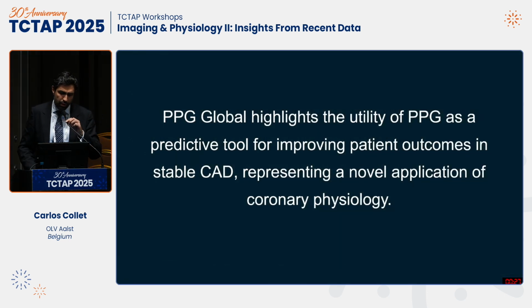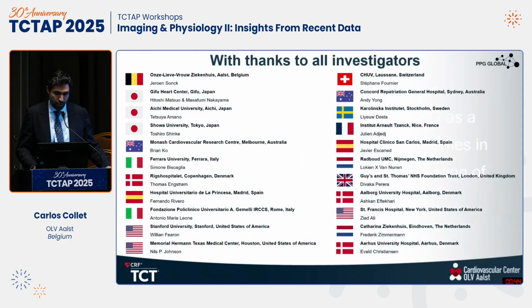Therefore, I think we can conclude that this PPG Global, this is a 1-year follow-up, highlights the utility of PPG in predicting patient outcomes by predicting the benefit of revascularization. And this is a completely novel application of physiology that, in my opinion, is more relevant than ever before.